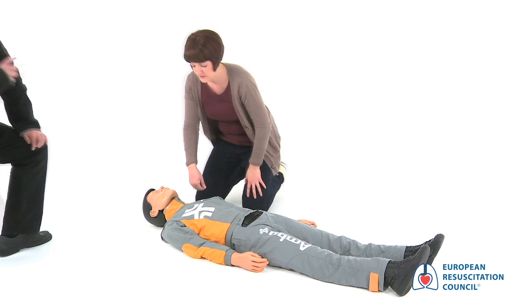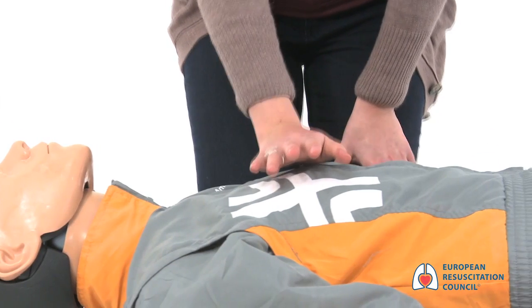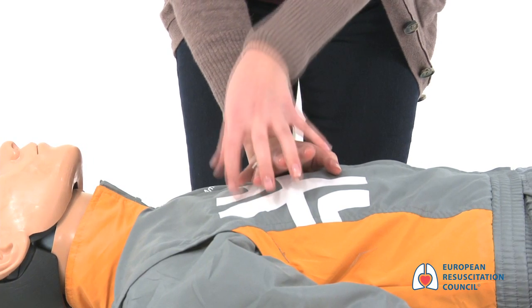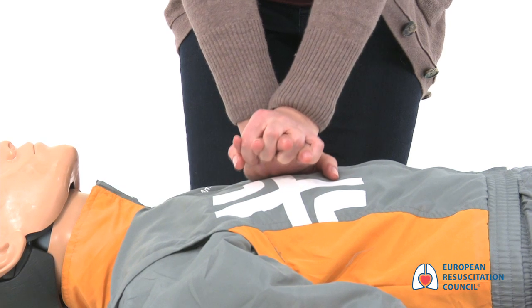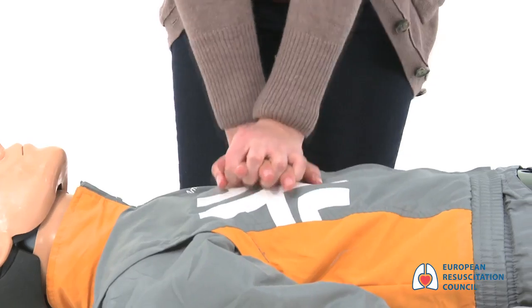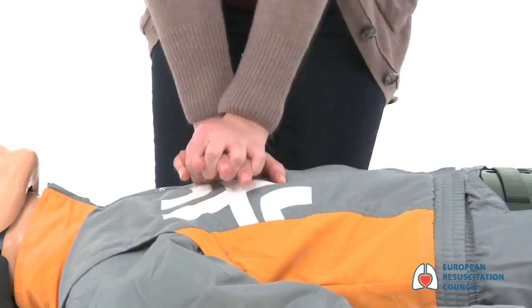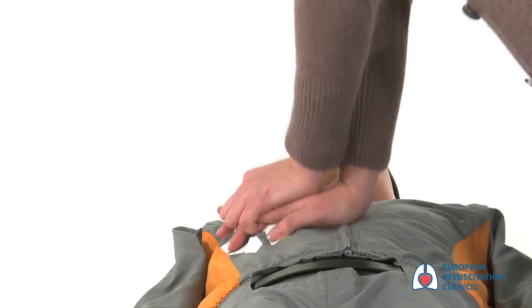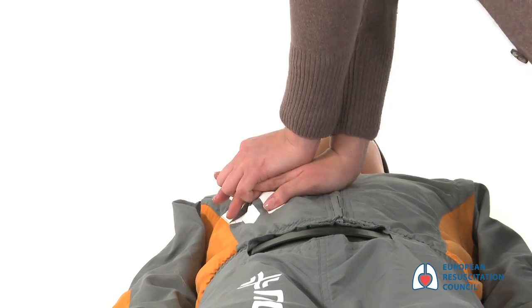Then place one hand in the centre of the chest. Put your other hand on top and interlock your fingers. Press the chest down 5-6 cm whilst keeping your arms straight. Press 30 times at a rate of 100-120 a minute, up to twice a second.